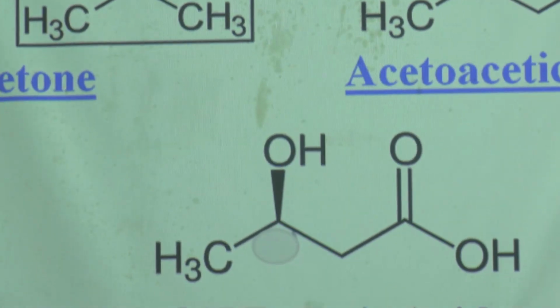So this is done for ketone bodies in urine. What are the ketone bodies basically? These are the three ketone bodies. You see what is ketone bodies? That must be a ketone group.